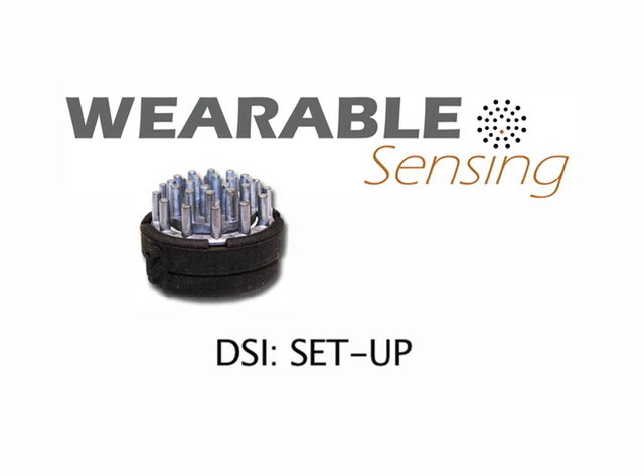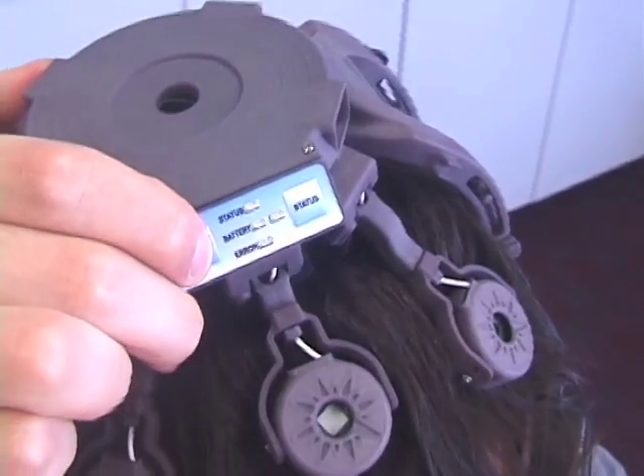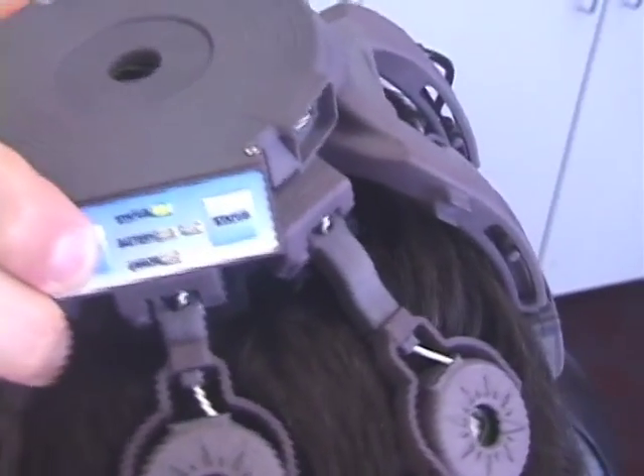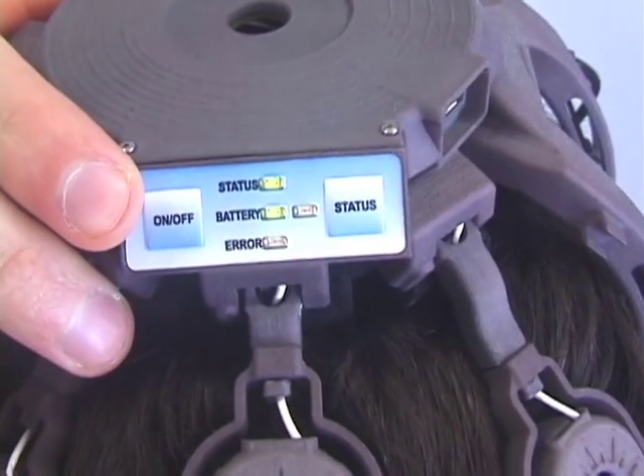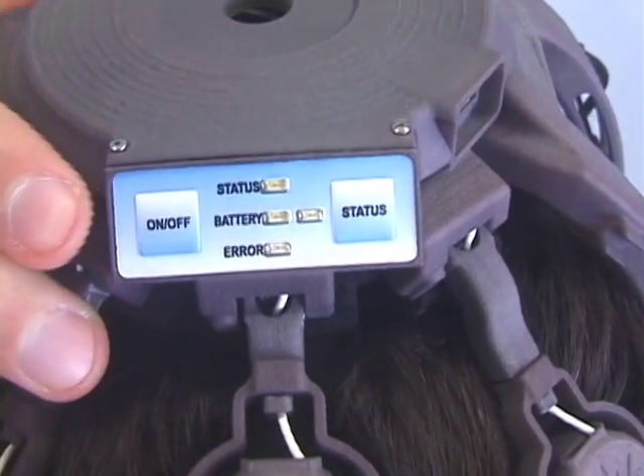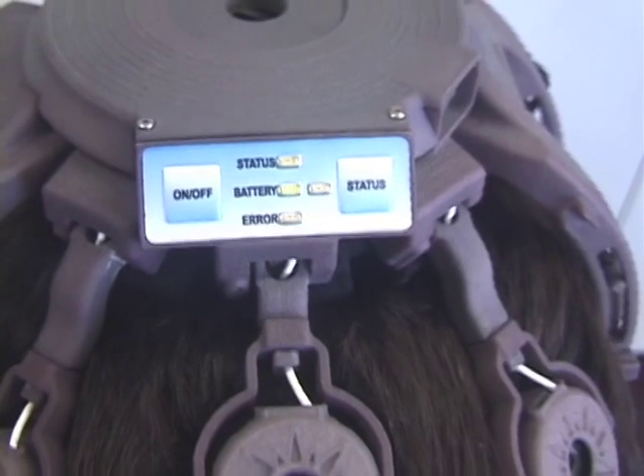This video shows how to set up DSi systems prior to recording EEG data. First, turn the system power on by pressing the power button twice within one second. On the DSi24, the battery indicator will start flashing to indicate that it is ready to connect via Bluetooth.